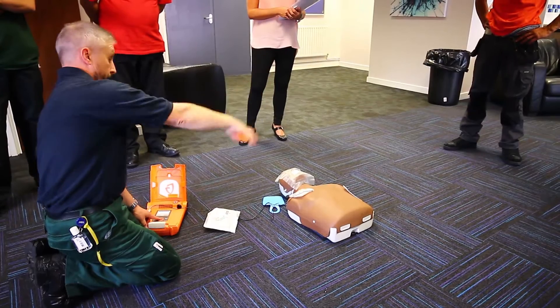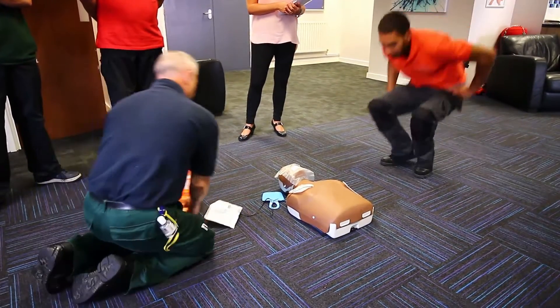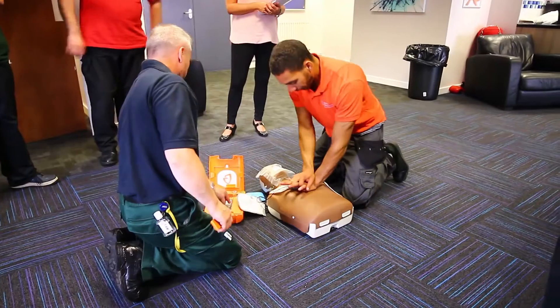It is now safe to touch the patient. Back on him again. Give 30 rapid compressions and 2 breaths.